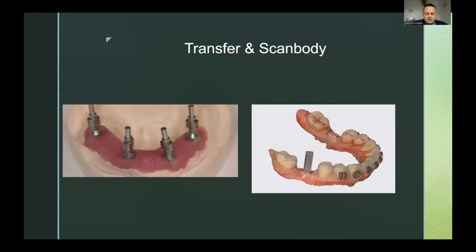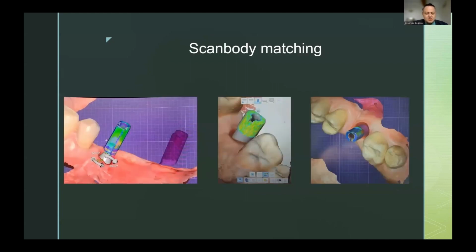After we do a good impression of the scan body and the computer starts matching this new library to the mesh, we're going to get a heat map, and this heat map will tell us how precise our scan was. Ideally, we should stay under 20 microns of precision.